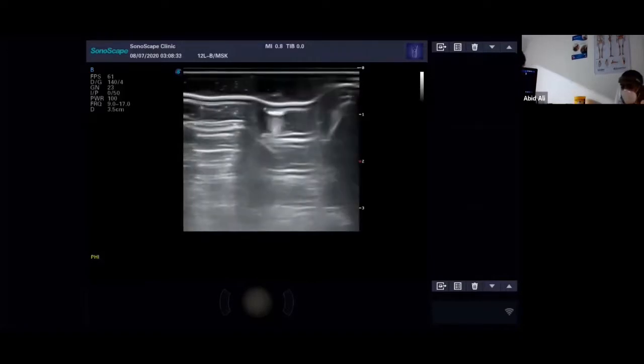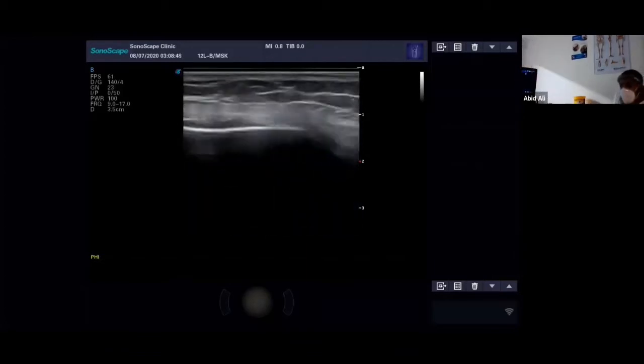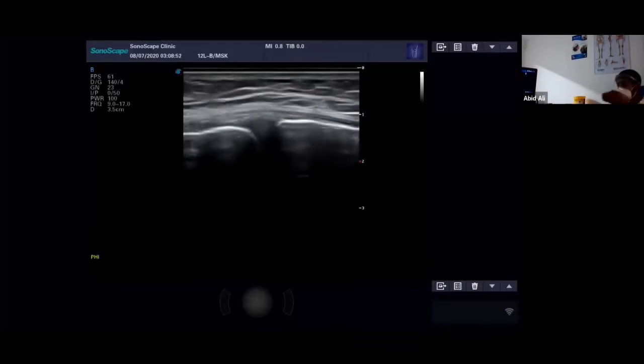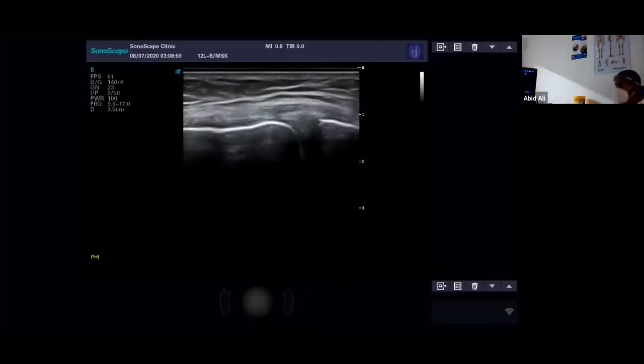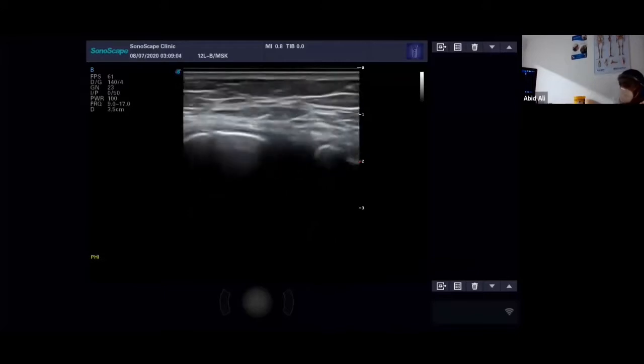Can I just say something about that, Adrian? I did a little experiment a few years ago with younger physios, trying to see how good they were at identifying the joint line and margin. We asked them to draw with a little pen where they thought the joint margin was, and then used ultrasound to show them where it actually was. Interestingly, not many got it right. People thought it was much lower than it actually was. So there are so many uses. It's not just for diagnostic stuff.